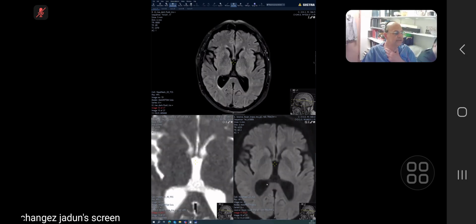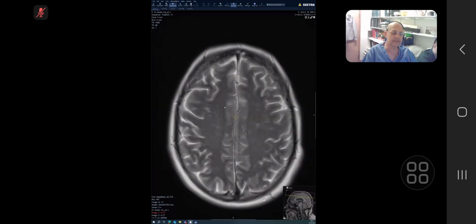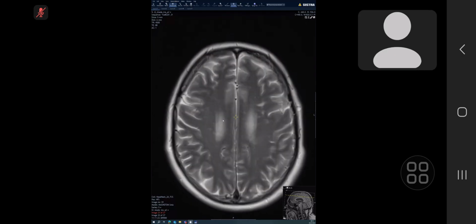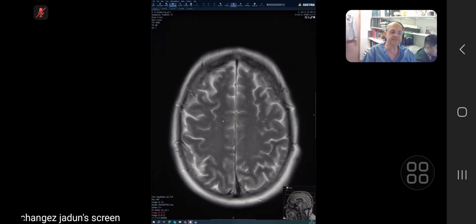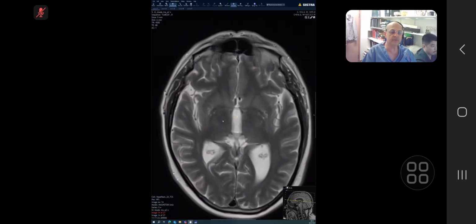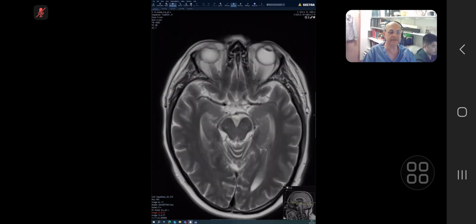So what is the thing that is missing in your observation? Let me sum it up for you. You did look at the white matter hyperintensities. You looked at the venous sinuses. But even on the T2 weighted sequence, you can see vessels being abnormal. Remember, the vessels have flowing blood, so they have flow void.